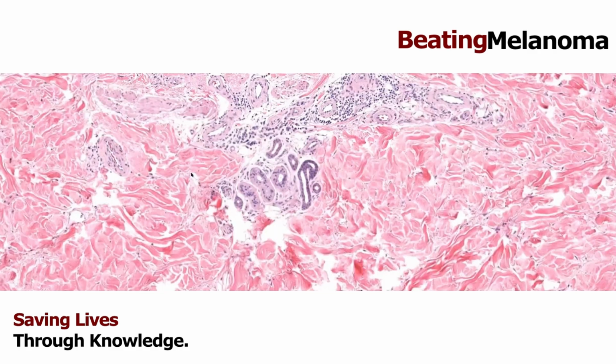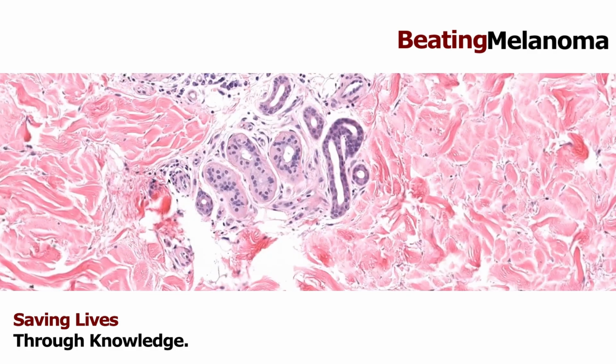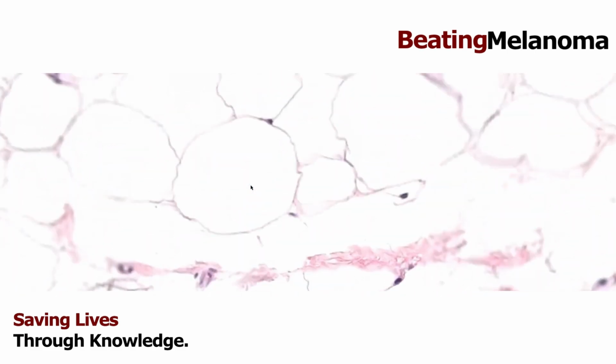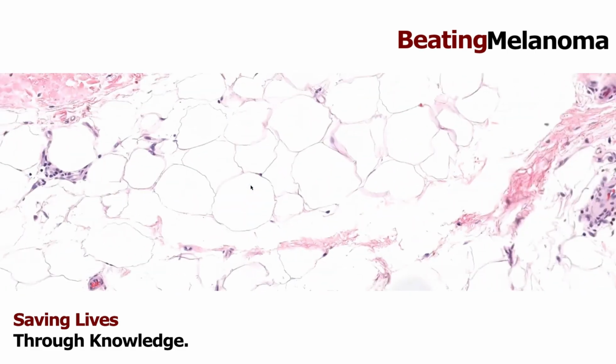And then down below, this is fat. This is what fat cells look like. And they look clear because all of the fat that's in them dissolves when we do those chemical bath steps of processing the tissue. All the fat dissolves and washes away and just leaves a little outline of their cells.